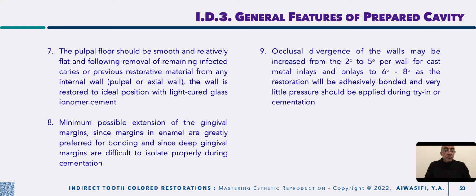The pulpal floor should be smooth and relatively flat, and following removal of remaining caries or previous restorative material, any internal wall is restored to be ideal in position with light cured glass ionomer, and this will be the function of, or the idea behind, lining.